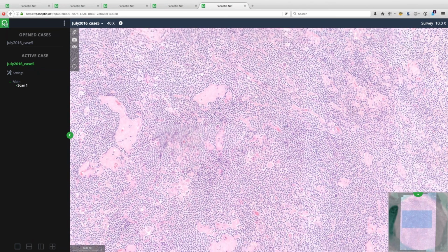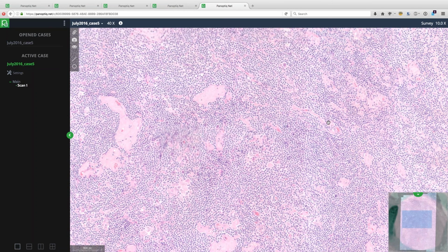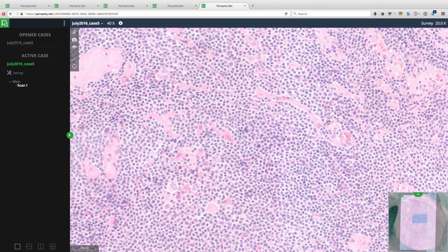But in this case, because of the presence of nodules, which I could very effectively demonstrate to my tumor board colleagues, this is actually an example of nodular lymphocyte-predominant Hodgkin lymphoma. For pathologists, we have different criteria, but when I'm presenting this to my clinical colleagues, I cannot become too technical, right? So I need to show them that although this entity stains very much like a diffuse large B-cell lymphoma, it is the presence of these large atypical cells along with these nodularities that moves it from the diffuse large B-cell lymphoma category to the nodular lymphocyte-predominant Hodgkin lymphoma category.